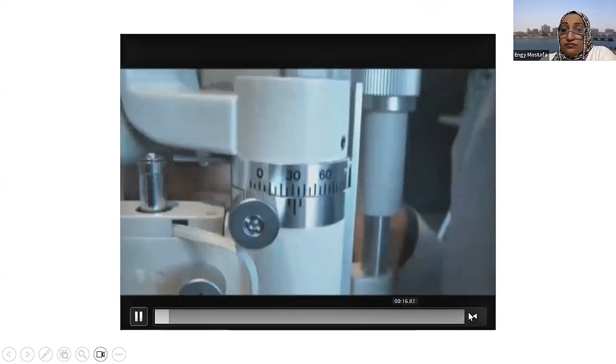Here, this is the corneal slit lamp optical section, and this is the black or empty space behind it, which is the AC, and this is the reflection from the iris, of course. So we are going to compare this thickness with the black or empty space behind it, which is the AC.